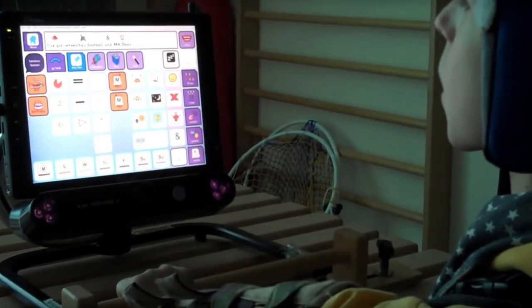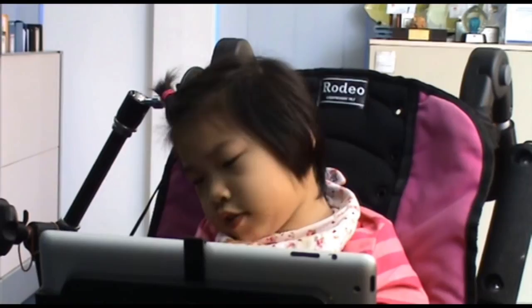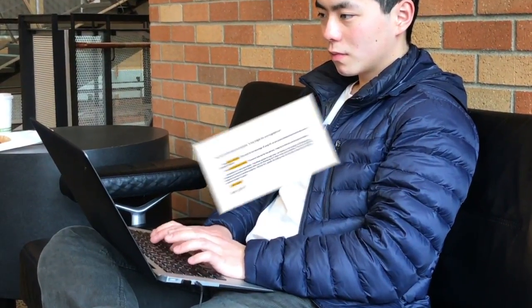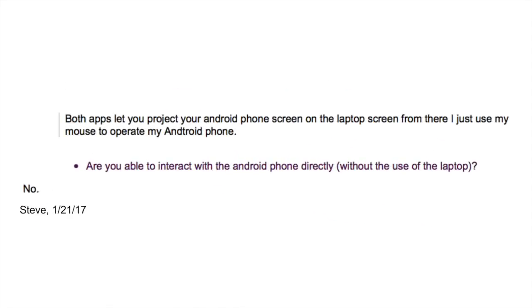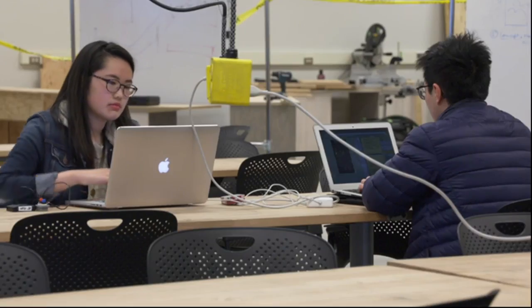Dedicated AAC systems can be expensive, bulky, and difficult to transport. They also often have a slow input rate, which leads to communication imbalance in conversations. We met with AAC researchers and reached out to Morse code AAC users in order to identify potential opportunities for our project. For the past 10 weeks, we have been working on a product that addresses these issues.